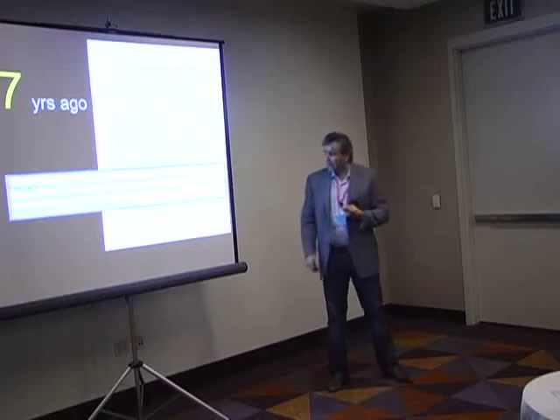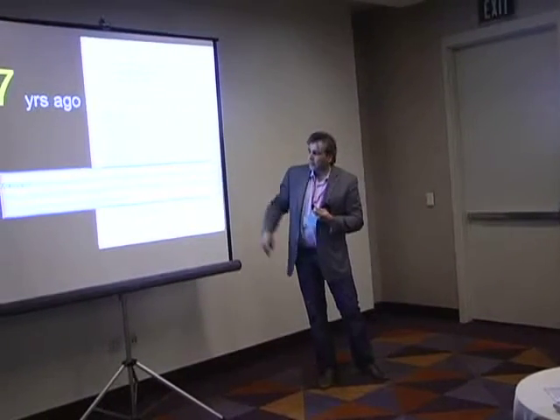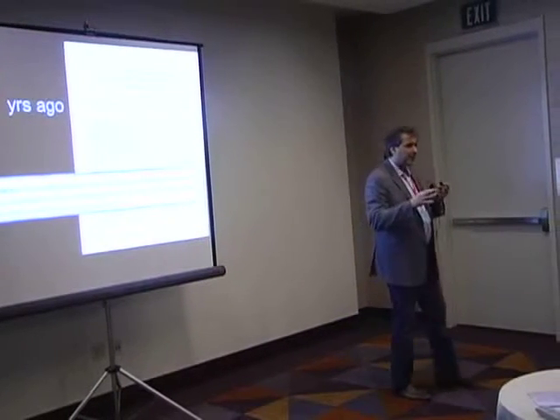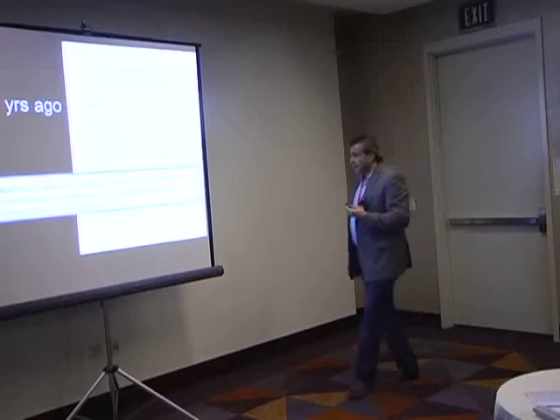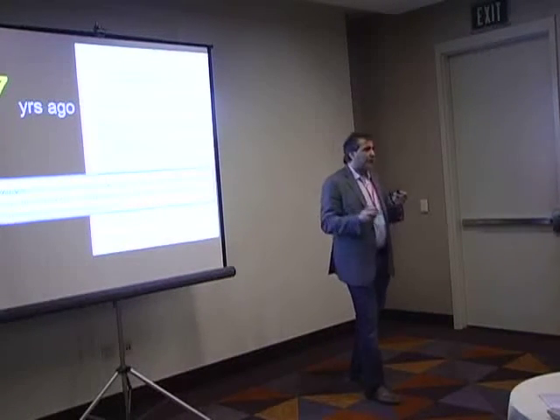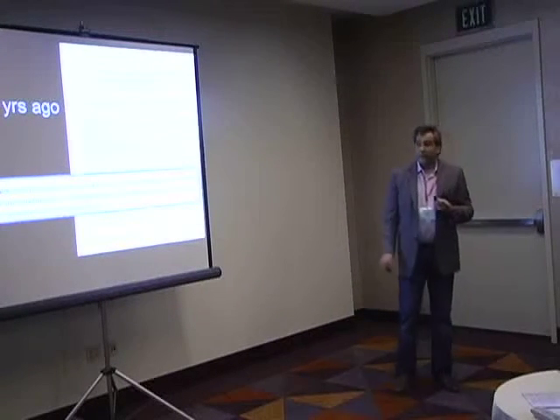Basically, we found that when we looked at eStim in general and its effect on delayed union and fresh fractures, there was significant diversity between the trials and methodological limitations that made it difficult for us to say. Well, we're not certain what the impact of this is. And we certainly can't make a strong recommendation that it works, and we were uncertain 7 years ago.